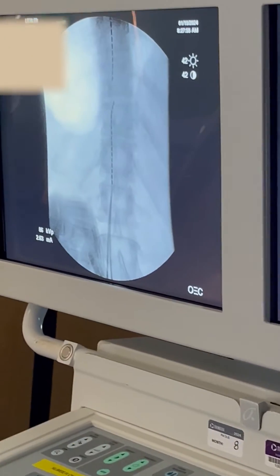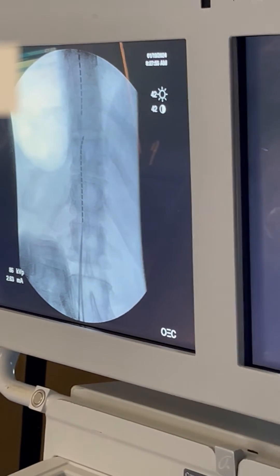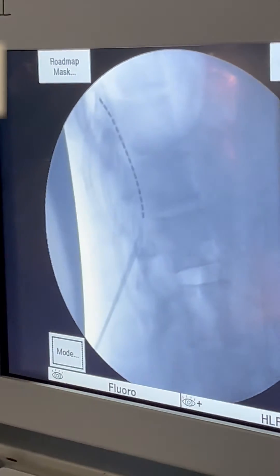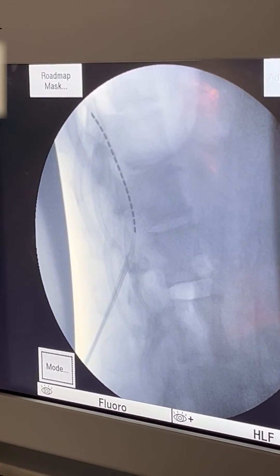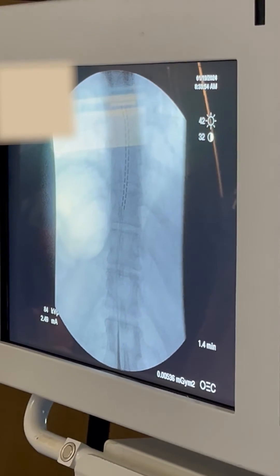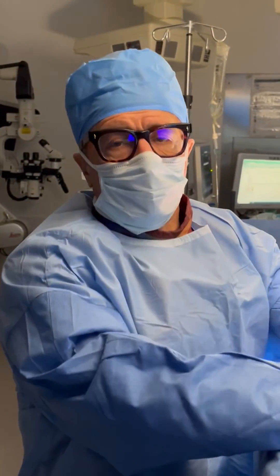Let's look at the screen. You can see on the left screen, that's the AP or front-to-back view — you can see our top lead up there, and then the second lead is just coming in. On the lateral view over here on the right screen, we know that we're posterior to the cord. So now we have our leads placed. They're parallel, they're not crossing over — they're up at the T7-T8 disc.